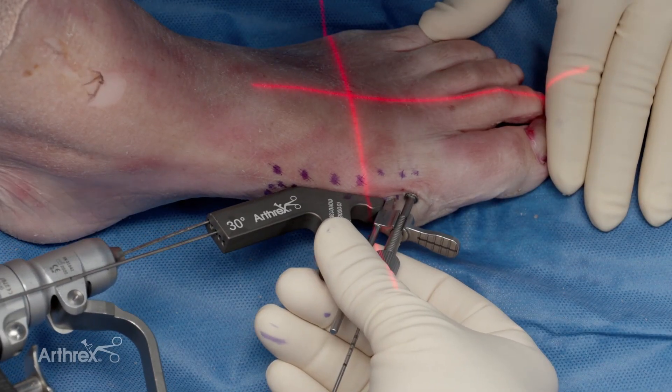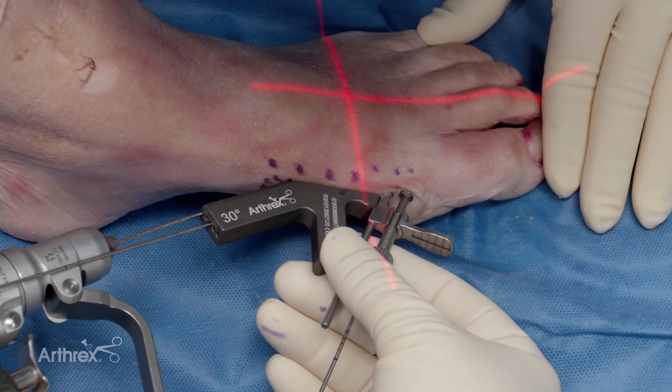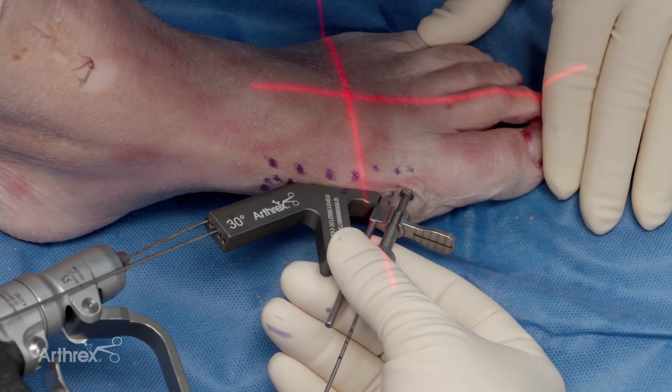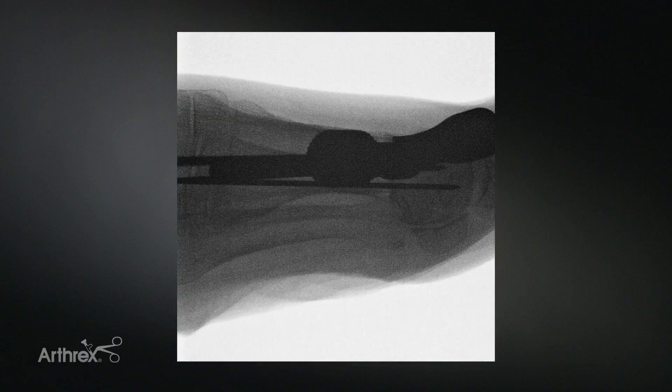Keep in mind you can put a little English on the guide before inserting it into the bone. If you just need another couple degrees, it won't be perfectly parallel, but sometimes that helps angle the more proximal screw a little more laterally. On the fluoroscopic image, the more proximal wire is exiting the lateral cortex proximally and entering the metatarsal head distally — giving you that tricortical fixation with the proximal screw. The parallel guide has successfully placed both K-wires in the metatarsal, both proximally and distally.